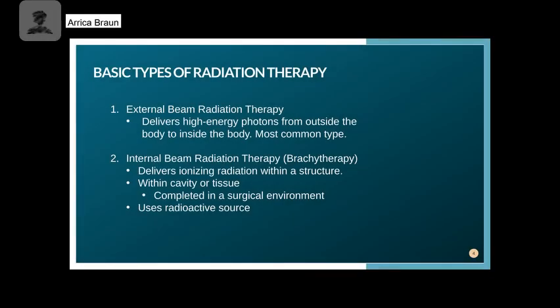Some basic types of radiation therapy. The most common that you probably think of is external beam radiation therapy. This is where we are delivering high energy photons from outside of the body and delivering it to inside the body. This is the one that's most commonly thought about and is the most widespread type of treatment.